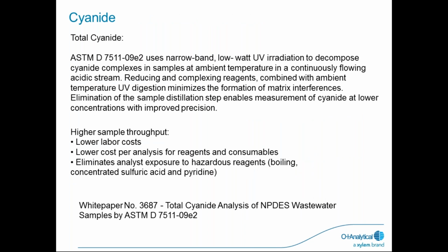Here's the total cyanide. ASTM D7511 uses narrowband low watt UV radiation to decompose cyanide complexes in samples at ambient temperature in a continuously flowing acidic stream. Reducing and complexing reagents combined with an ambient temperature UV digestion minimizes the formation of matrix interference.